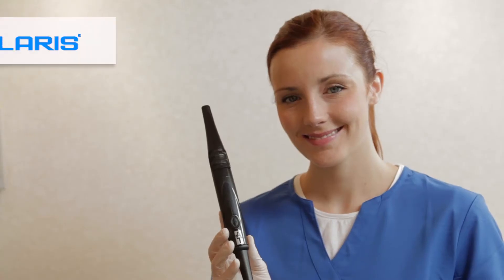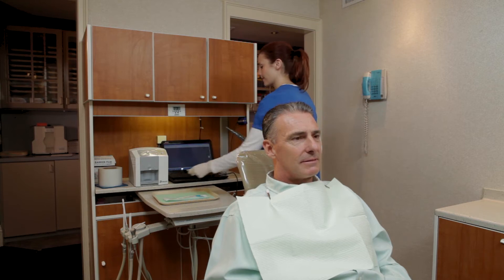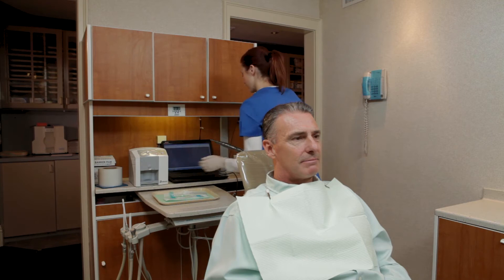Use the Polaris intraoral camera to enhance your patient diagnosis and case presentation. Turn the camera on by pressing the power button. Place a sheath over Polaris with the blue label of the sheath facing up and the LED lights of the handpiece facing down. Open the imaging software and activate Polaris by clicking the camera icon.